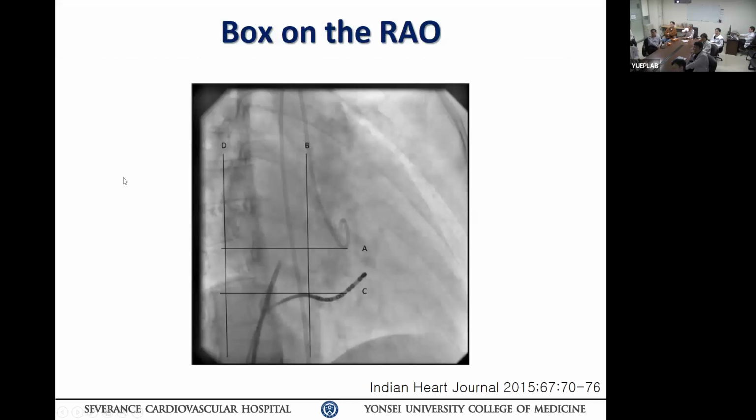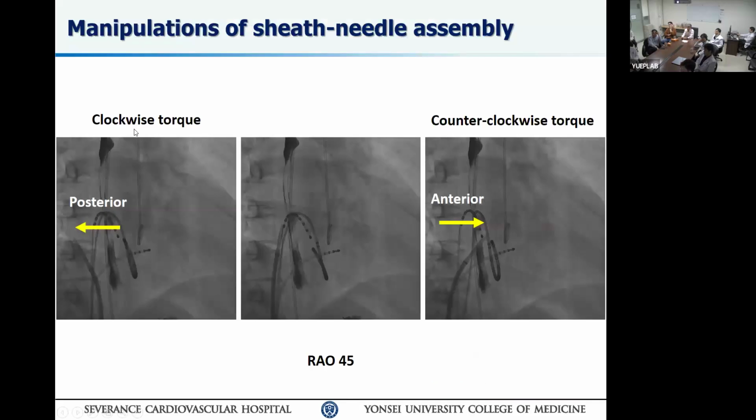So just forget this image, okay? His orientation is perfect. So the X-ray position for transseptal would be the CS coming at you in RAO, and in LAO, his bundle coming at you, his bundle catheter. Therefore, two catheters are important for transseptal, like in any other SVT or AT case. Keep going. So when you're talking posterior, it's not that posterior. You're talking about maybe 5 degrees or less, okay? We're not talking about this big a motion. Okay, keep going. Keep going down, being good.